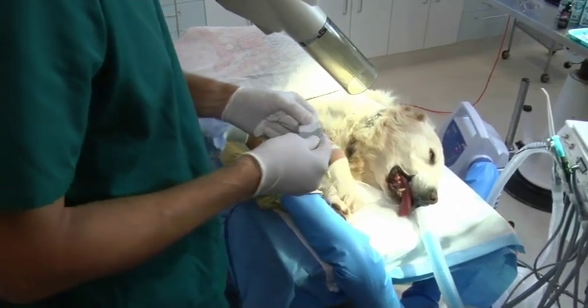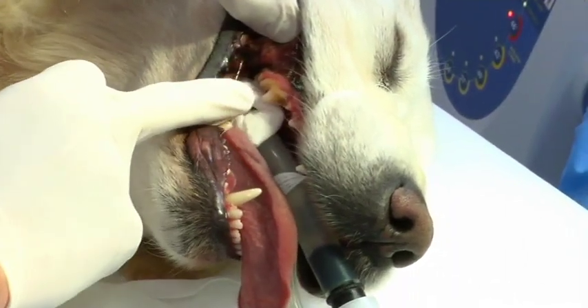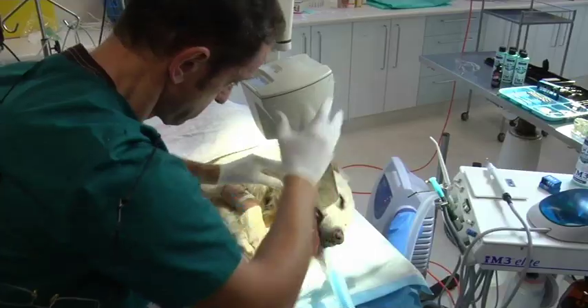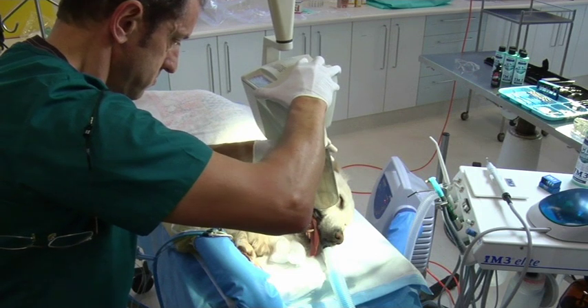Now we are going to take a radiograph of the upper premolar tooth that we are going to extract. This tooth is a supernumerary tooth. We place the film into the mouth and we are going to use the bisecting angle technique to take a radiograph of that premolar tooth.